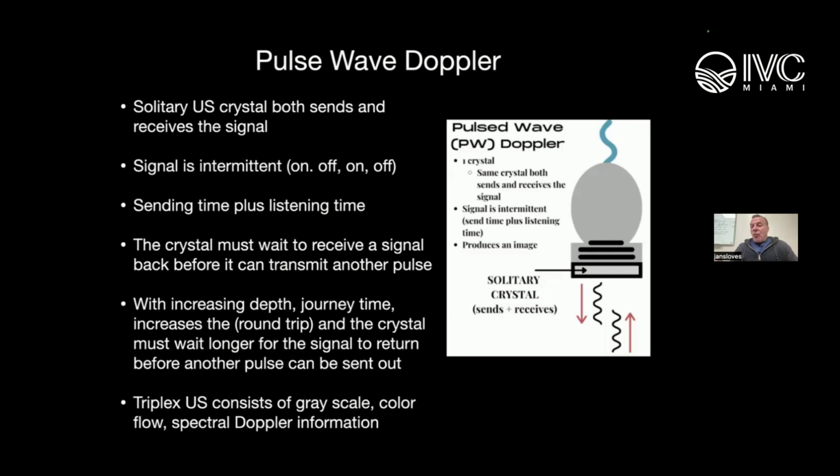In the right patient, that's a kind of screening tool for me to see if they may have an outflow obstruction. But after that, for the determination of reflux for the deep and the superficial, they are standing. It has to be standing. Yeah, I'm a stickler for that.